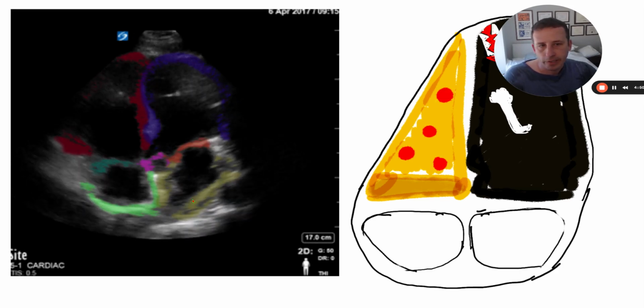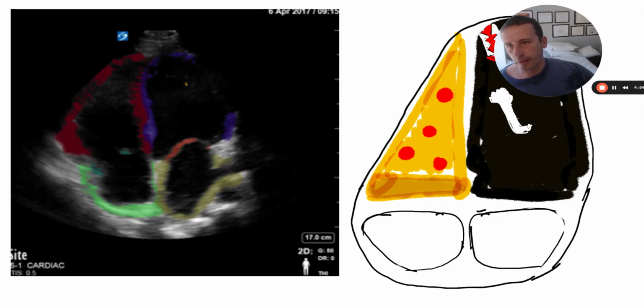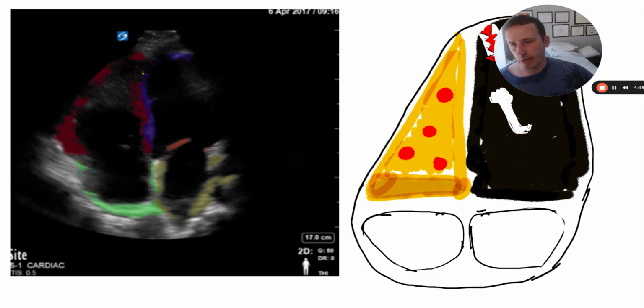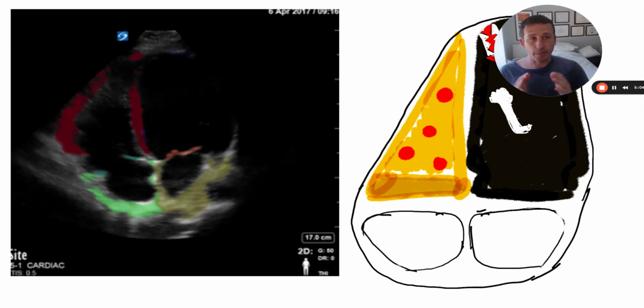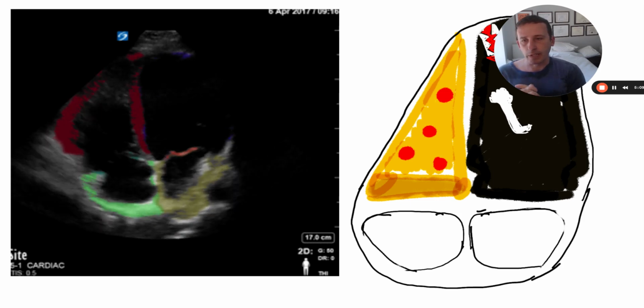Here's our colorized version. Again, LV more bullet shaped, RV more pizza shaped. We've got our LV outlined here in kind of a royal blue, and then RV in red, and then our RA and LA deep to those things. The best view, you're going to see both valves at the same time, so that mitral and tricuspid valve. You're also going to see the atria.